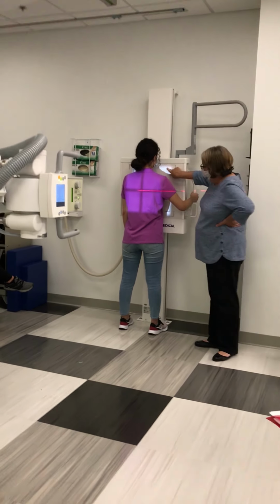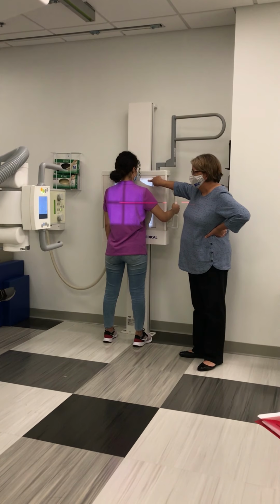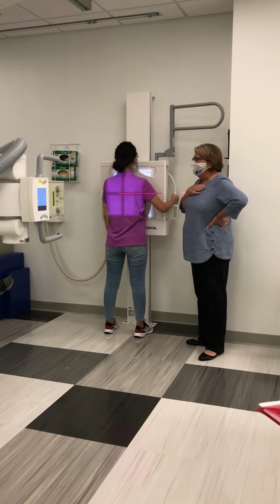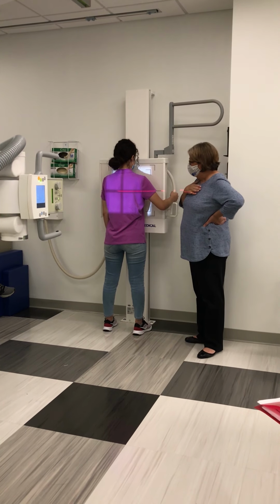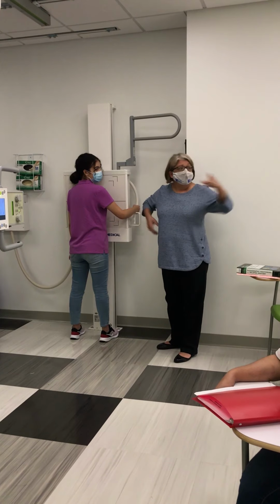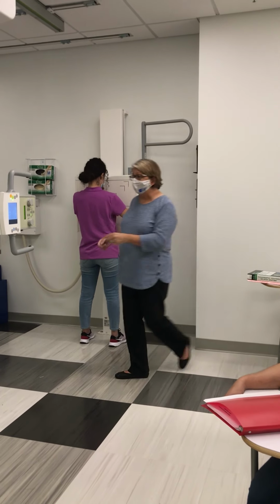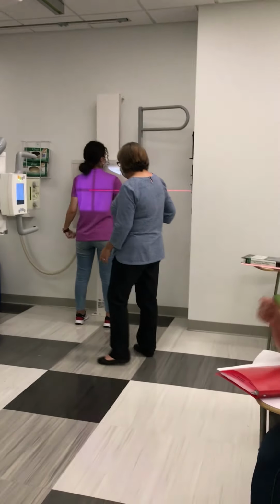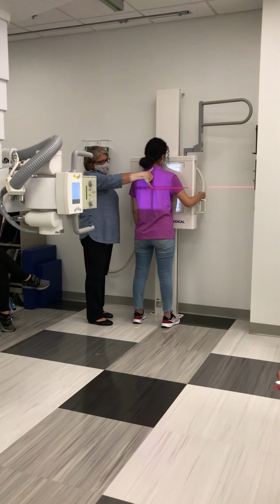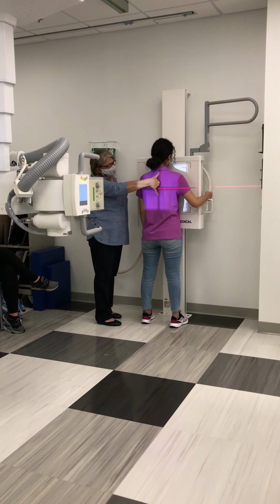Now you see how I have a couple of inches of light above her shoulders. That is a good indication to me that my centering is good. Why is it important to have that light above the shoulders? The apices, yeah, the right and left apex. Good.